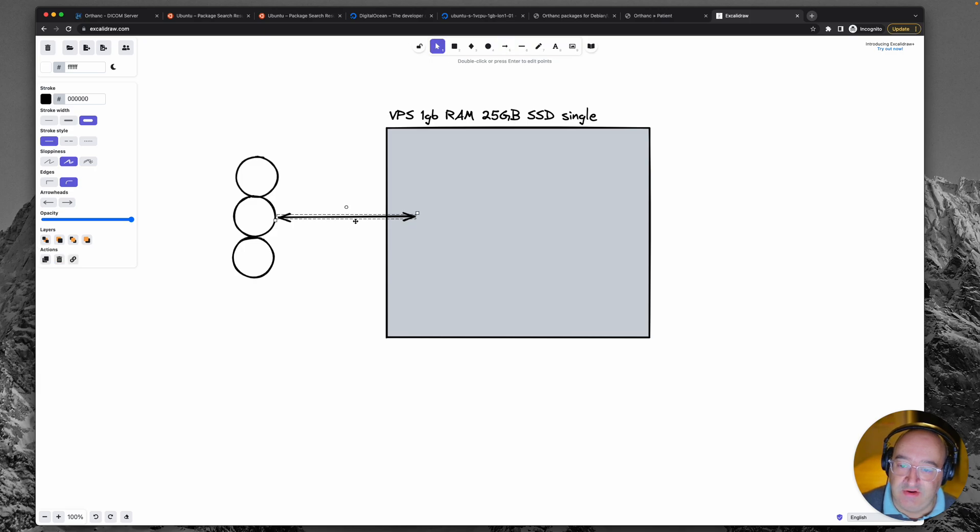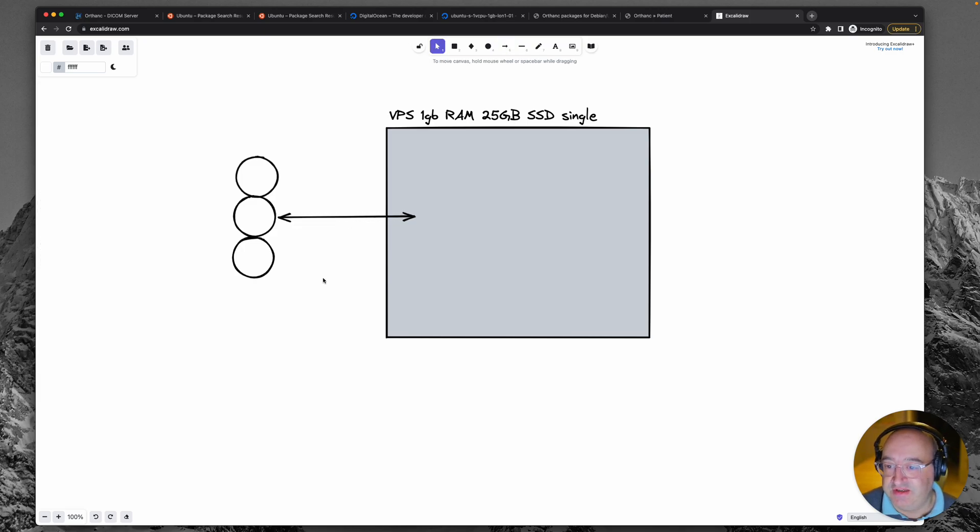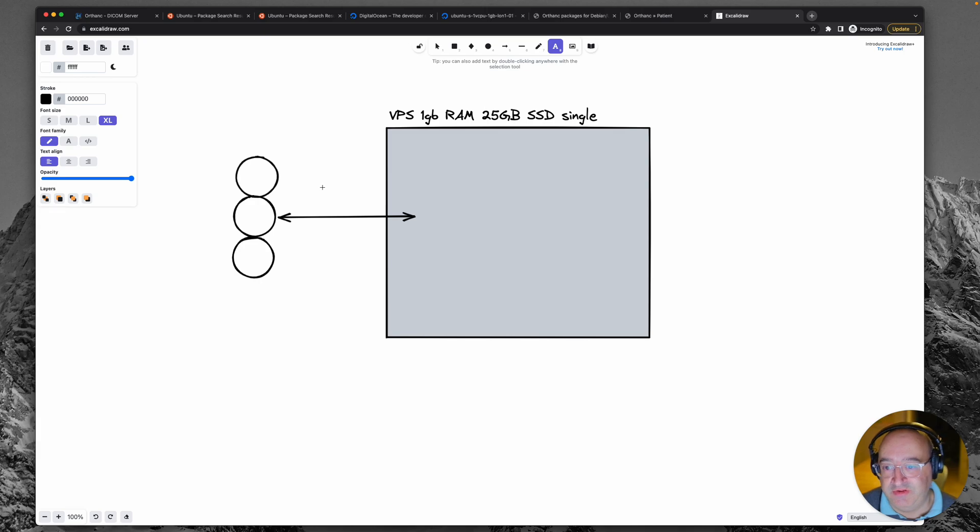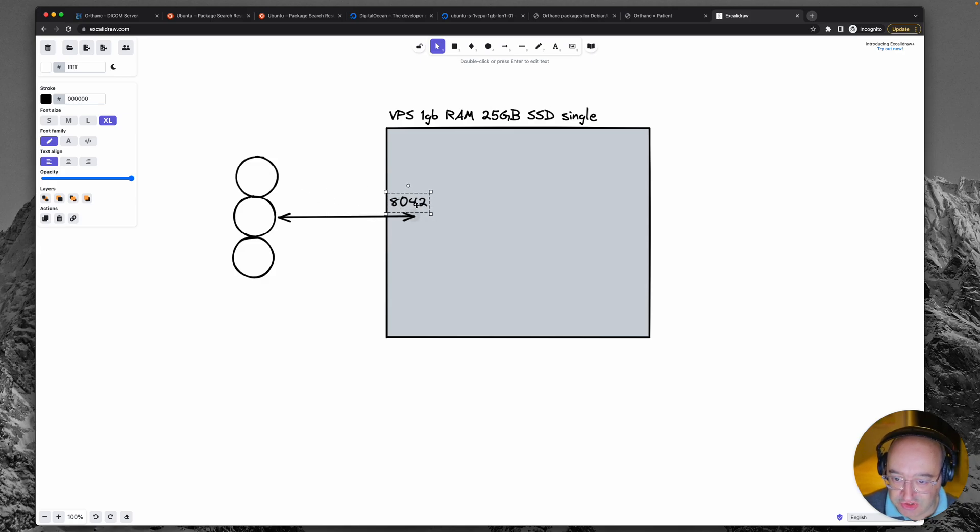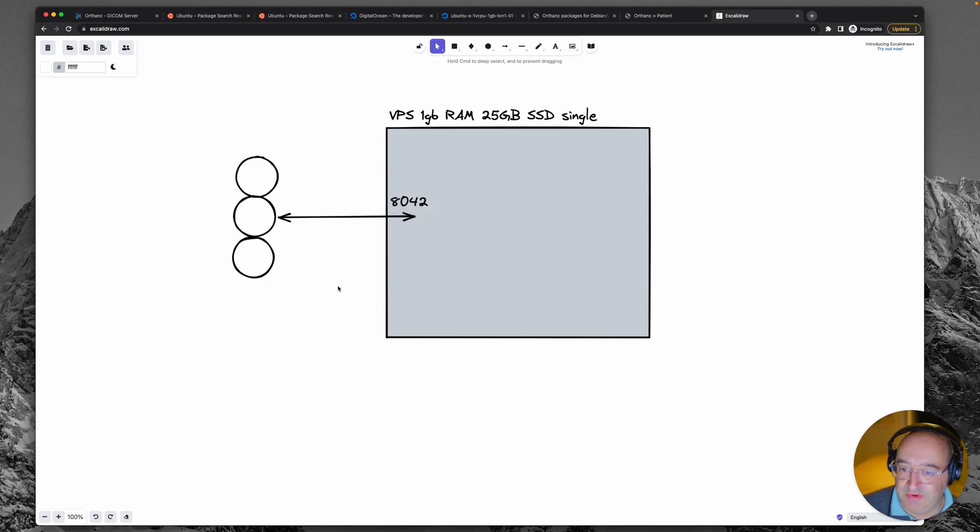And they will be both sending and receiving data and you remember that at the moment that happens on port 8042, although that's very unconventional and it's something we're going to fix.